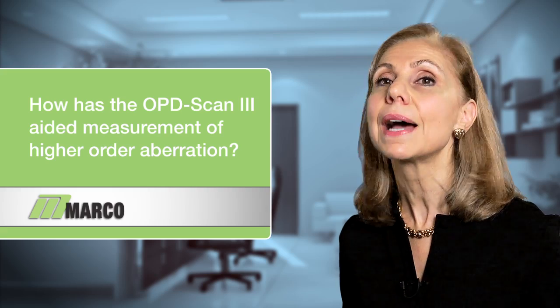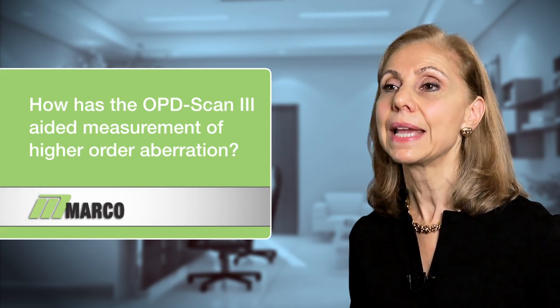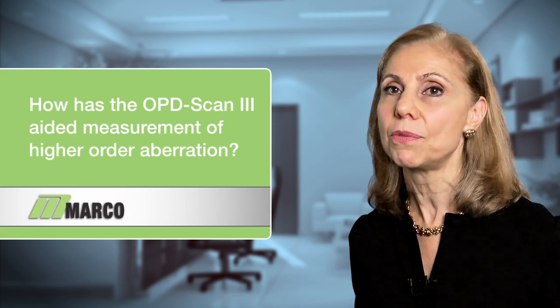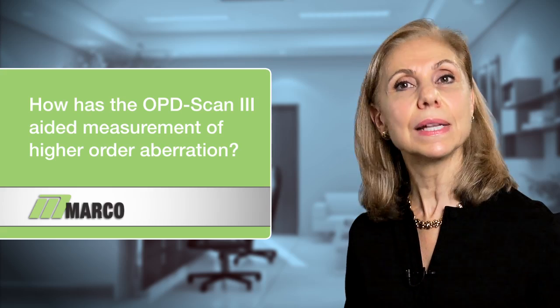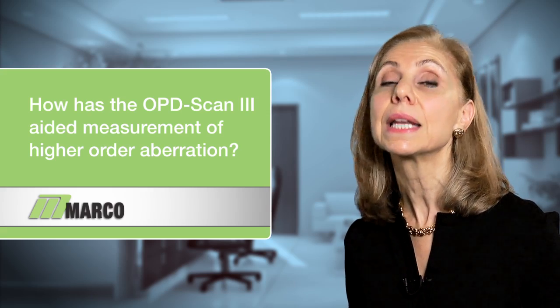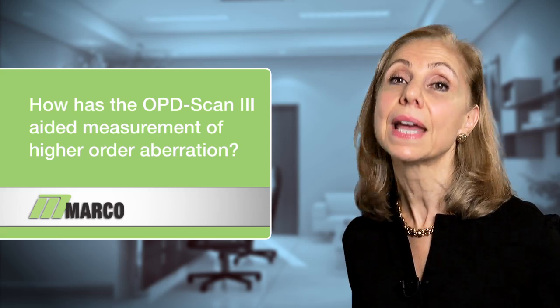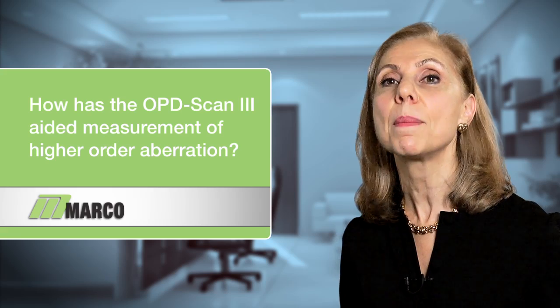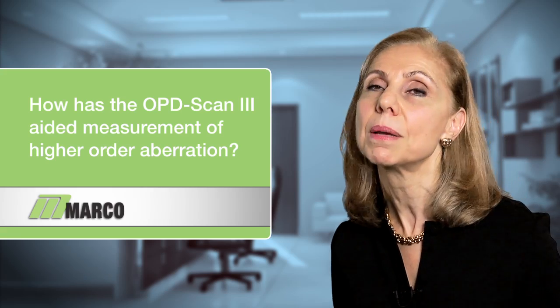So as a result, I don't get complaints anymore from patients saying, I didn't realize I would still have a little bit of glare or a little bit of feathering from oncoming headlights or when I look at a street lamp. It's all discussed ahead of time. The expectations are set. Moreover, it's part of their higher order aberration, and that cannot be corrected. And it's through the OPD-3 that I'm able to not only understand it myself, but explain it to the patient and their family members.